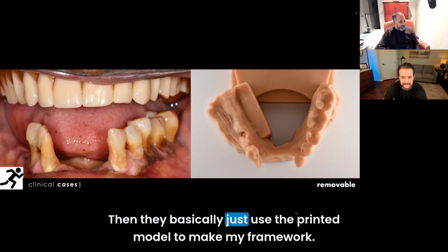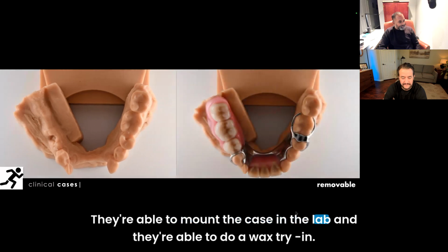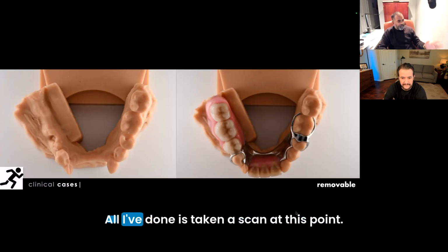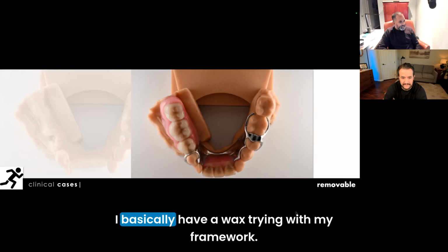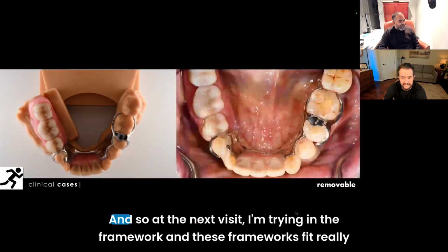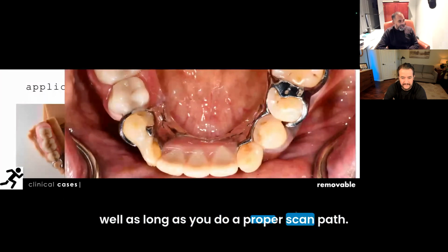Then they basically just use the printed model to make my framework. They're able to mount the case in the lab, and they're able to do a wax try-in. So at the next visit, I haven't taken an impression. All I've done is taken a scan at this point. I basically have a wax try-in with my framework. And so at the next visit, I'm trying in the framework. And these frameworks fit really well as long as you do a proper scan path.